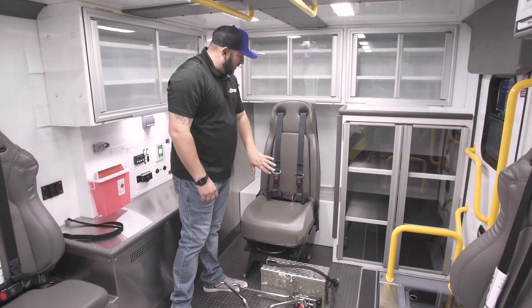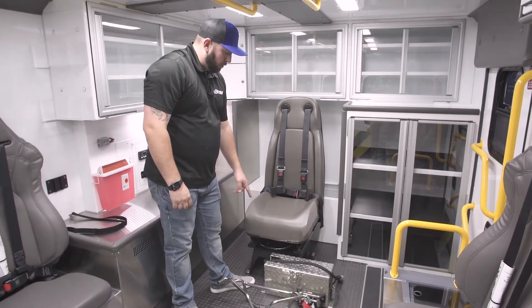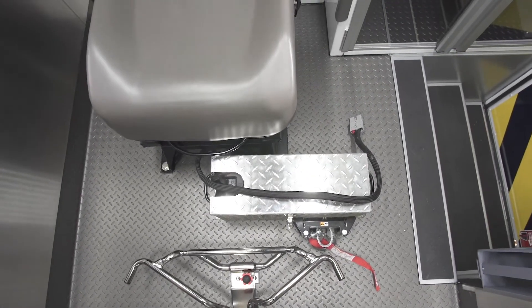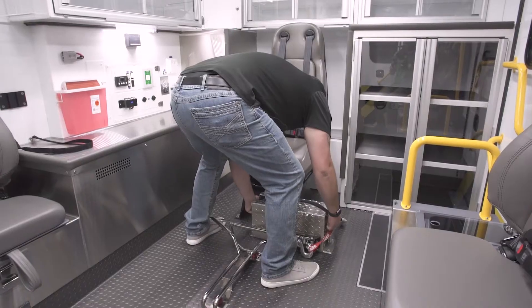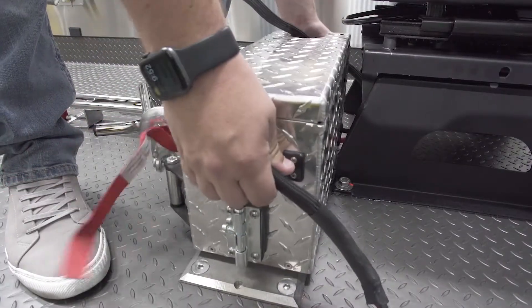With the captain's chair slid all the way into the forward position so it doesn't block access to the floor plate, be mindful of the red tether and the power harness. Set the box down onto the plate, and then slide it towards the passenger side so it locks into place into the keyed holes on that plate.